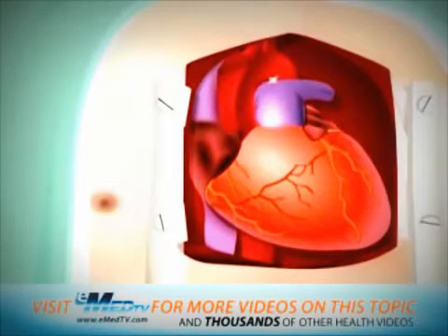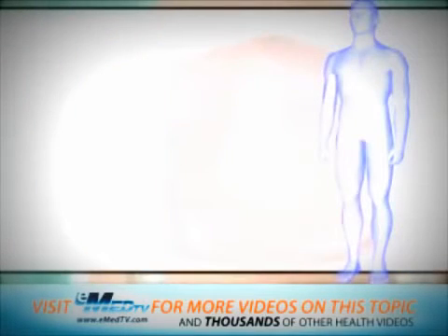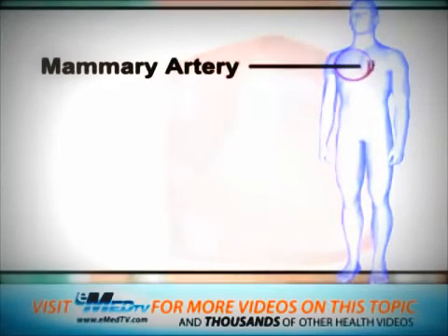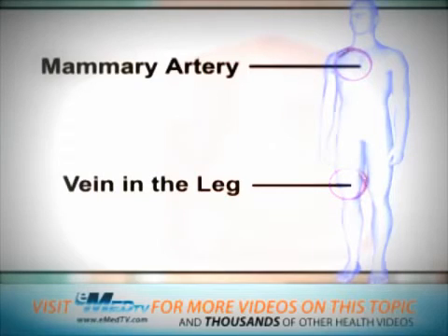At this point, the doctor will remove the necessary graft vessels for the artery bypass. Most commonly, an artery from the chest called the mammary artery and/or a vein from the leg are used. However, an artery from the arm or wrist may also be used.